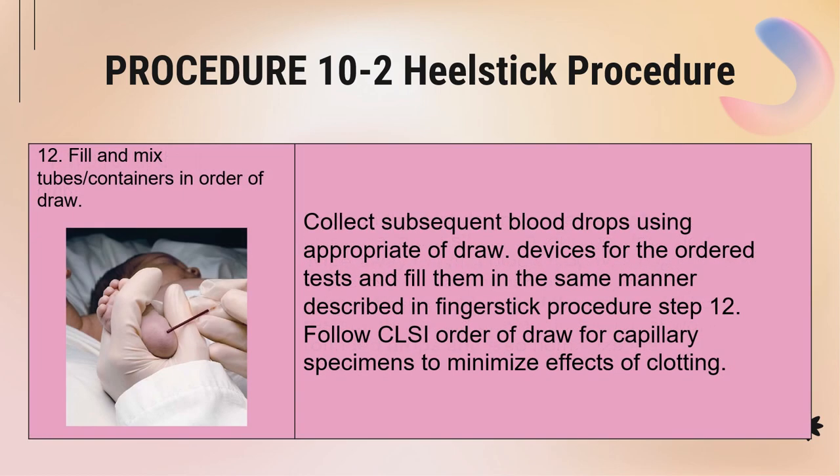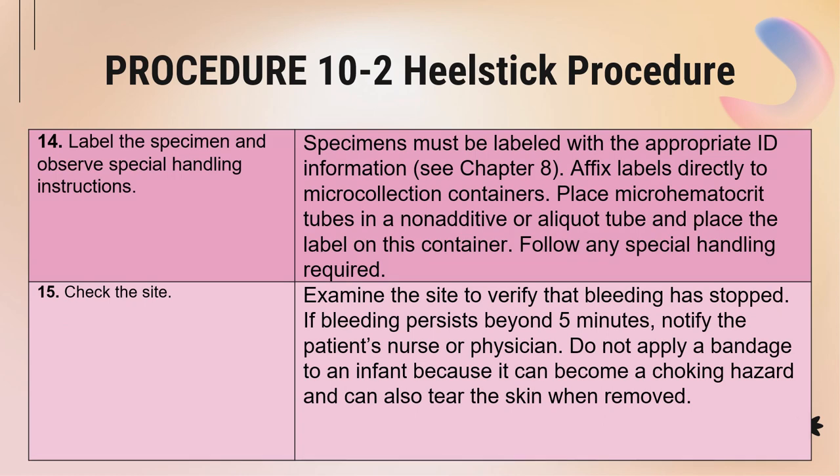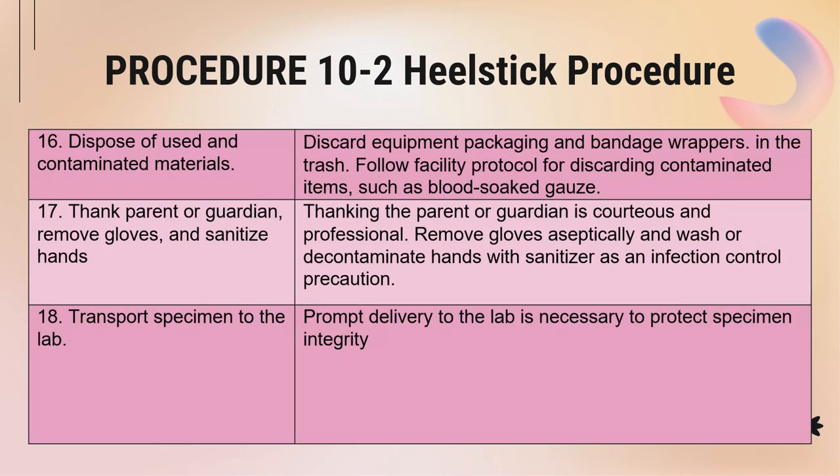12, fill and mix tubes and containers in order of draw. 13, place the gauze and apply pressure. 14, label the specimen and observe special handling instructions. 15, check the site again for any bleeding. Again, take note, beyond 5 minutes of bleeding, you should notify the patient's nurse or the physician. Okay, so 16, dispose of used and contaminated materials.